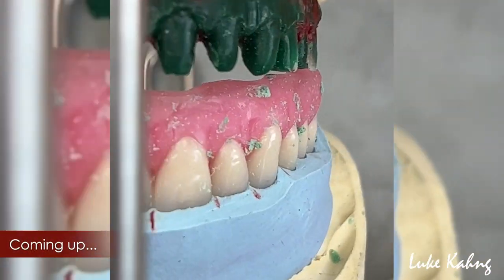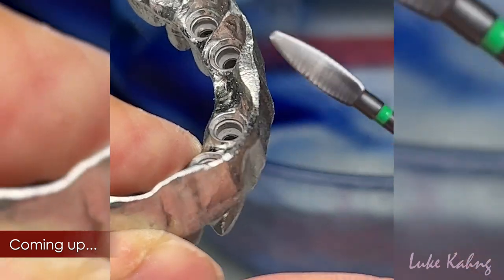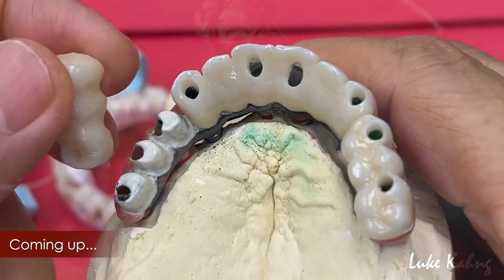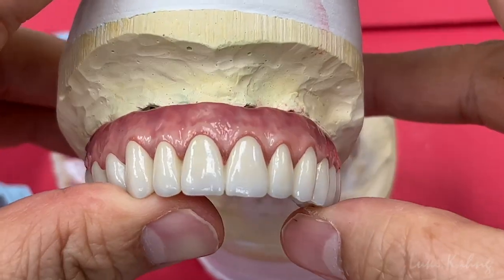This is the final finished CITAN 7-star case. It's an over 20-year-old implant. We made the wax and casting because you cannot scan it. In many cases we made it two-piece, and we're going to cement together.